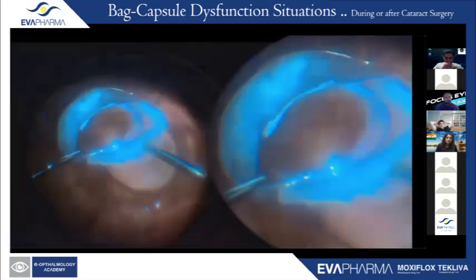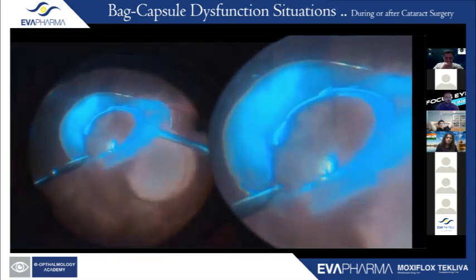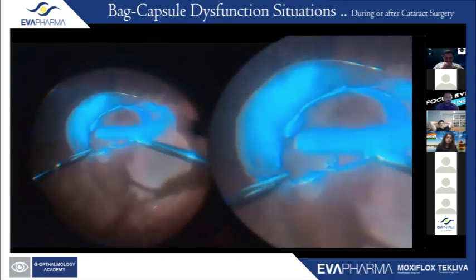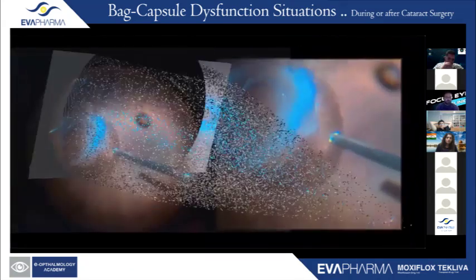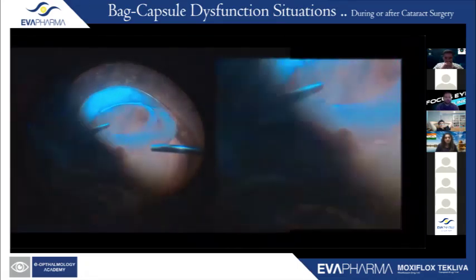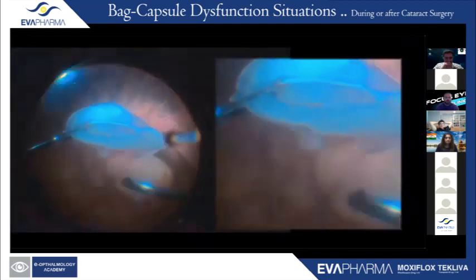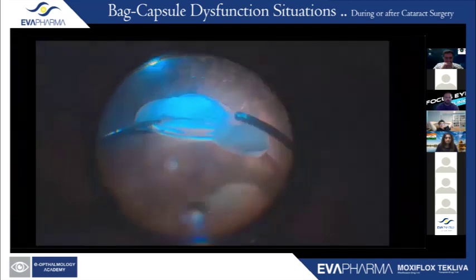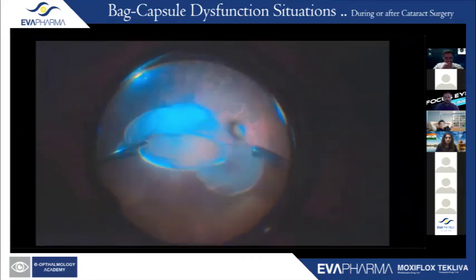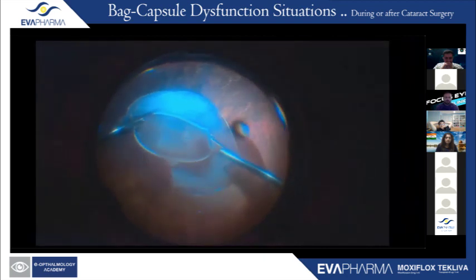Often these are old patients, and these lenses are old also. So before cleaning the IOL, you cannot know if the lens is actually usable. You can see here that the haptic has already suffered some damage during the implantation from the anterior segment surgeon.